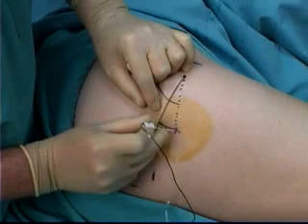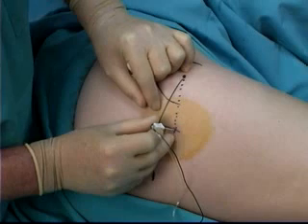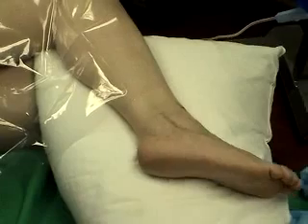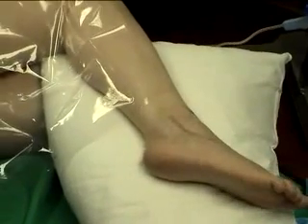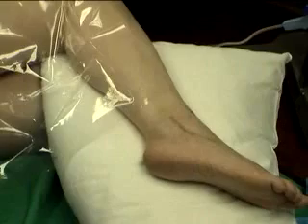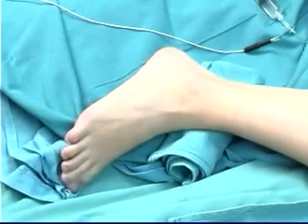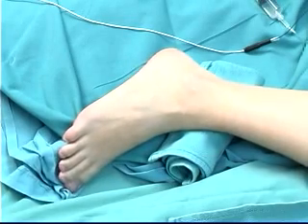The 22-gauge 50 to 100 millimeter stimulating needle enters the skin perpendicular to the skin until the sciatic nerve is stimulated. If the medial aspect of the sciatic nerve is stimulated, the motor response will be plantar flexion of the foot. More lateral on the sciatic nerve, the motor response will be eversion of the foot. Injection of local anesthetic agent or normal saline will cause the muscle twitches to stop immediately.